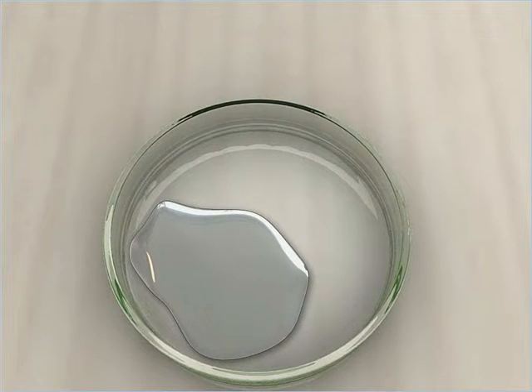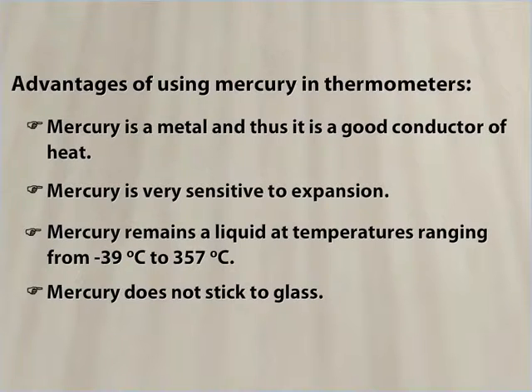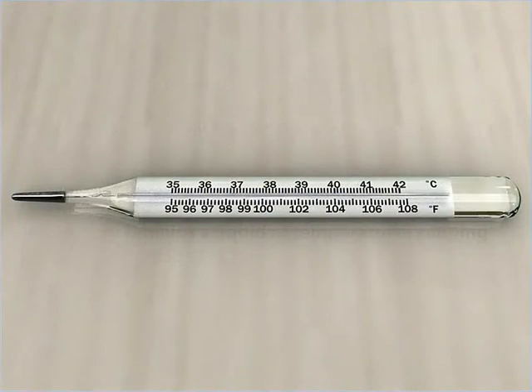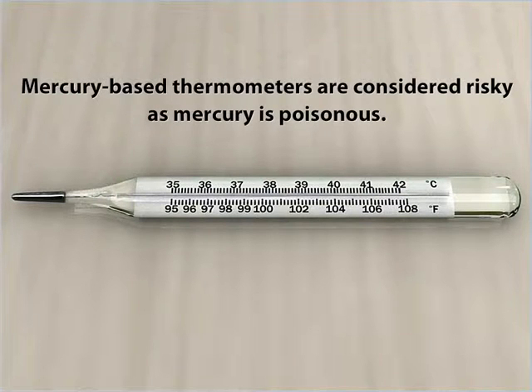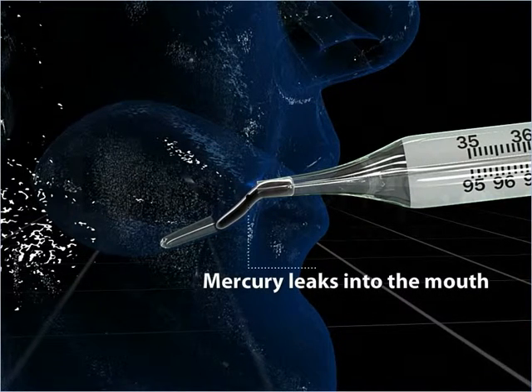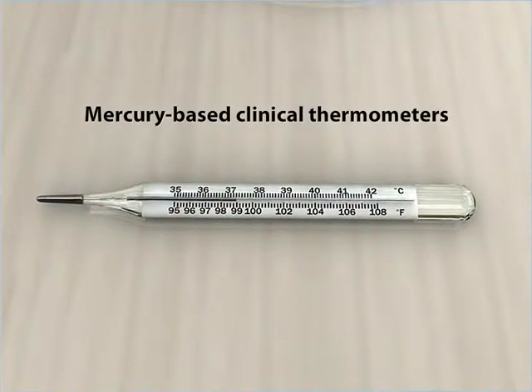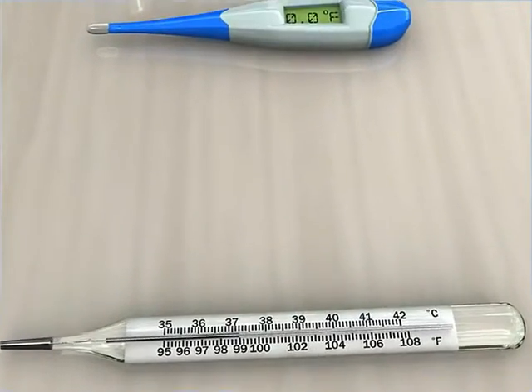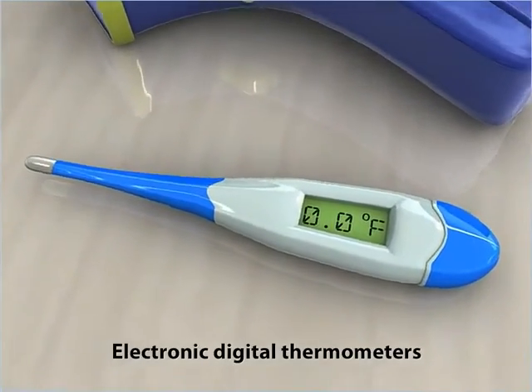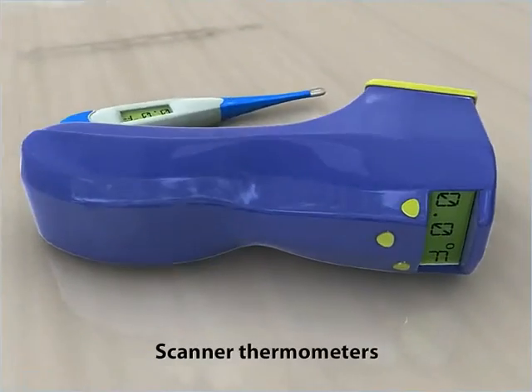And lastly, mercury does not stick to glass. Though using mercury in thermometers has advantages, mercury-based thermometers are considered risky because mercury is poisonous. In case the bulb or the neck of a thermometer breaks, mercury can leak out into the mouth. This is why mercury-based clinical thermometers have largely been replaced nowadays with electronic digital thermometers or scanner thermometers.